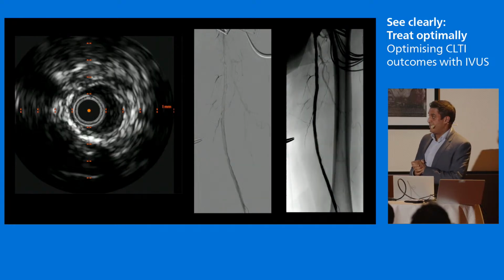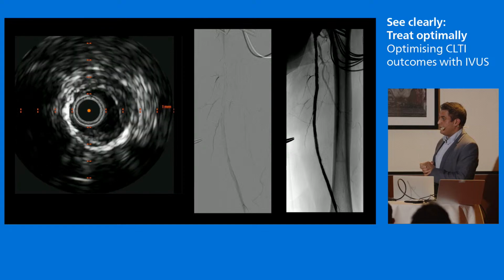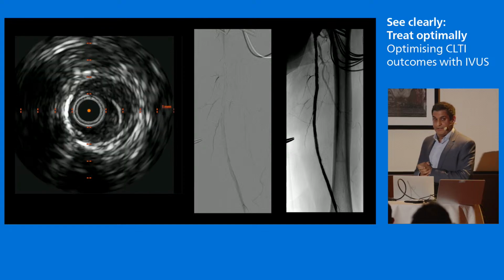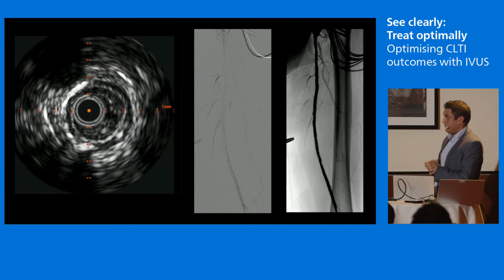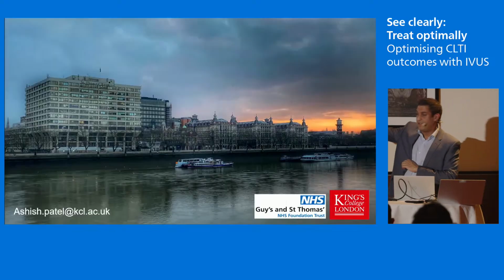Great flow on the angiogram. But the IVUS doesn't look right. It's not even that subtle. It's actually quite obvious. If you see that on an IVUS, your case is not done, and look for a problem with the inflow.